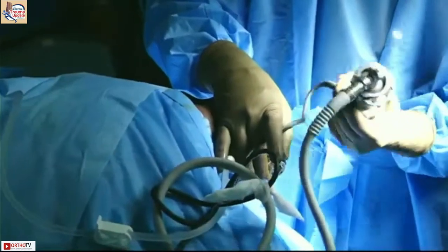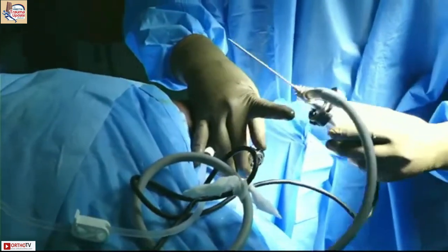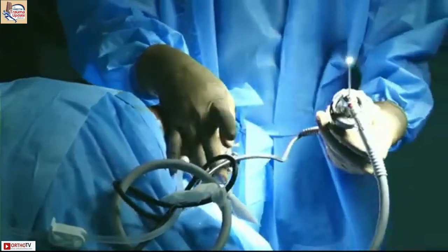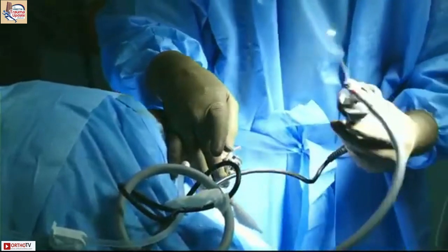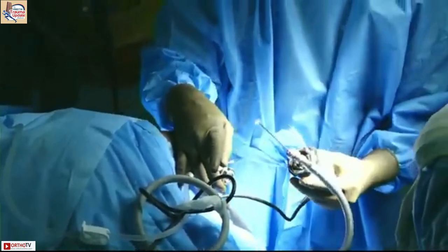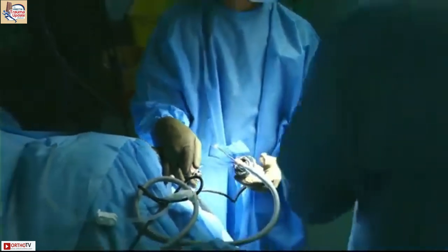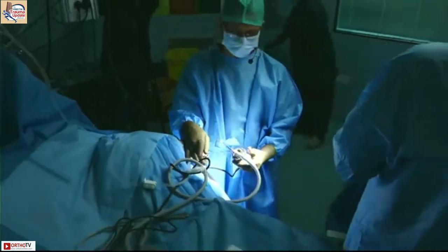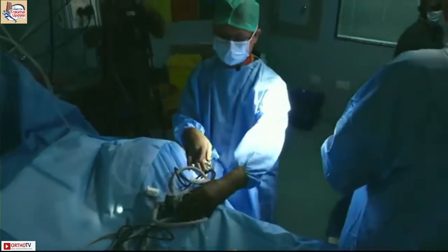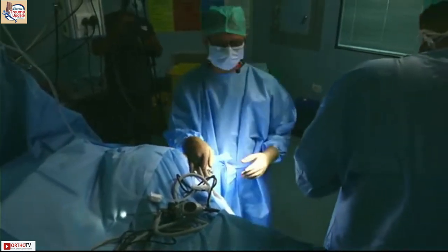Sister, what scope is this? Gautam. Yes. I think they've given me a 2.7 sheath, but I think it is a 2.4 scope. Yeah. The length of the scope does not matter to the sheath. Please give a 2.7 scope. And there is one Arthrex 3 mm scope if you want to try that. So Ganesh, please help them. Easy. That's okay.